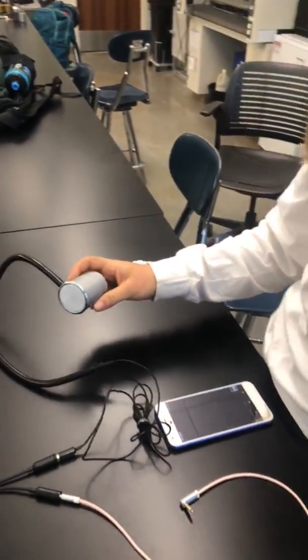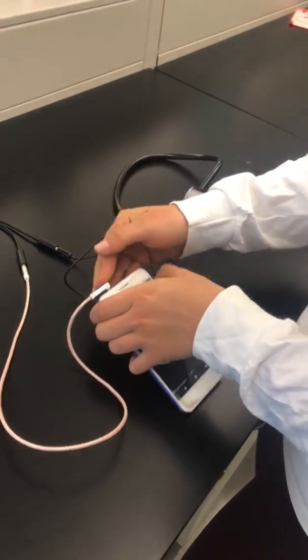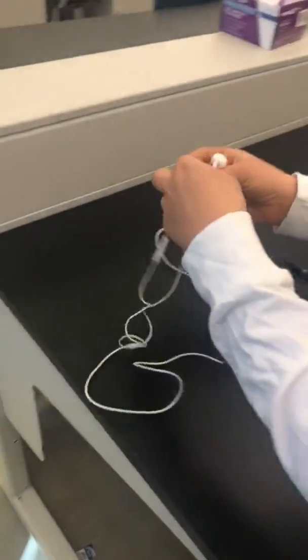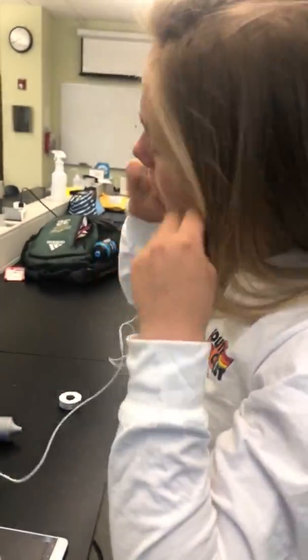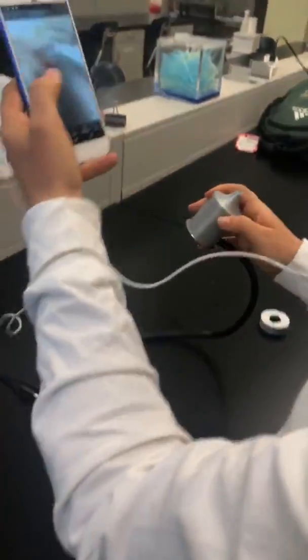I'm not feeling so good — I think I might need to call my doctor. So I'll just plug this into my phone, put on the headphones, and give my doctor a call.